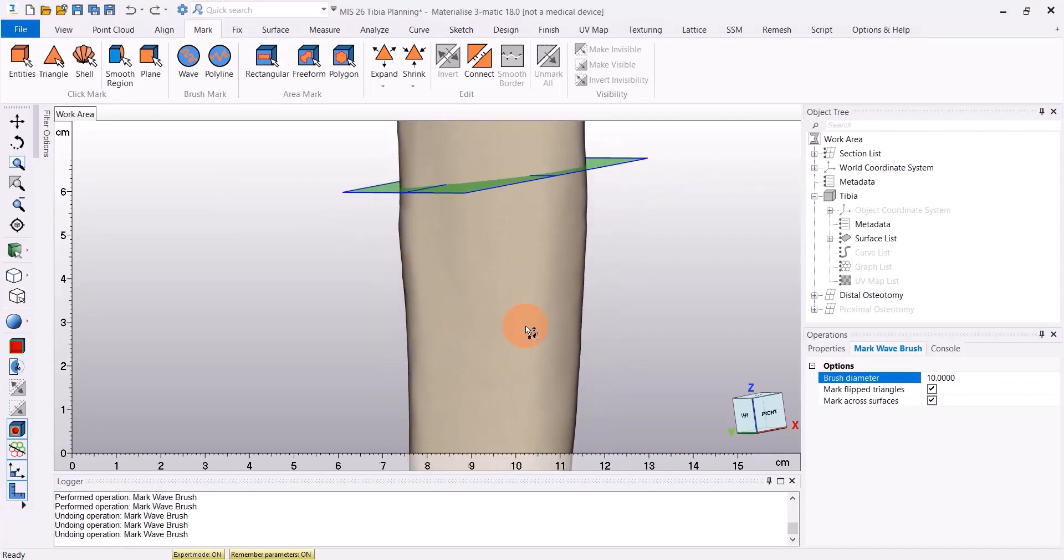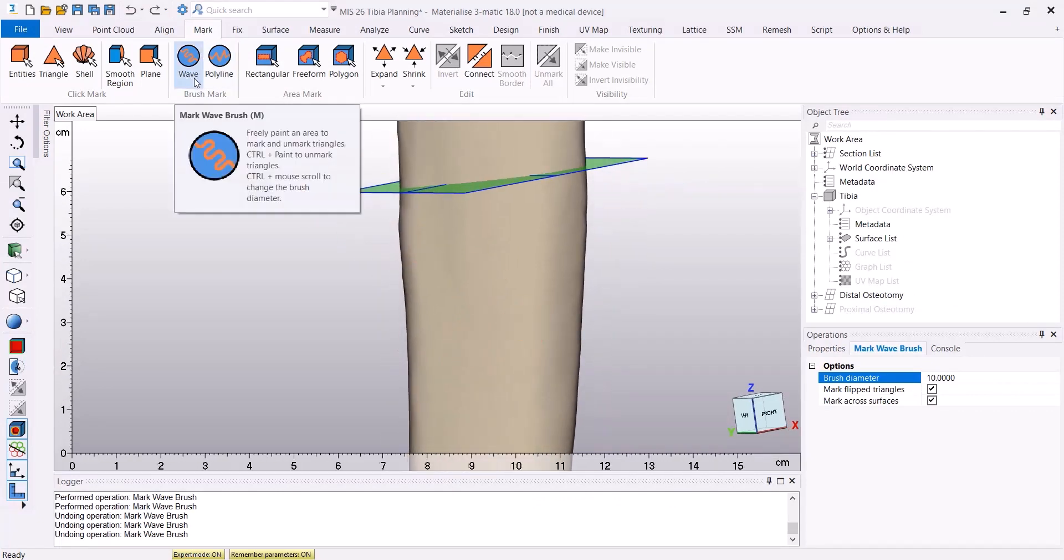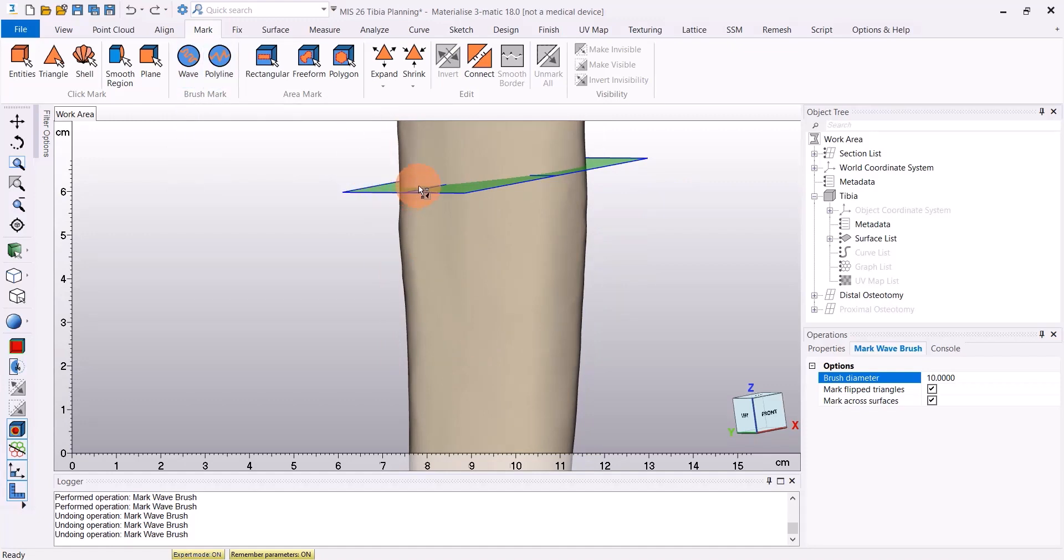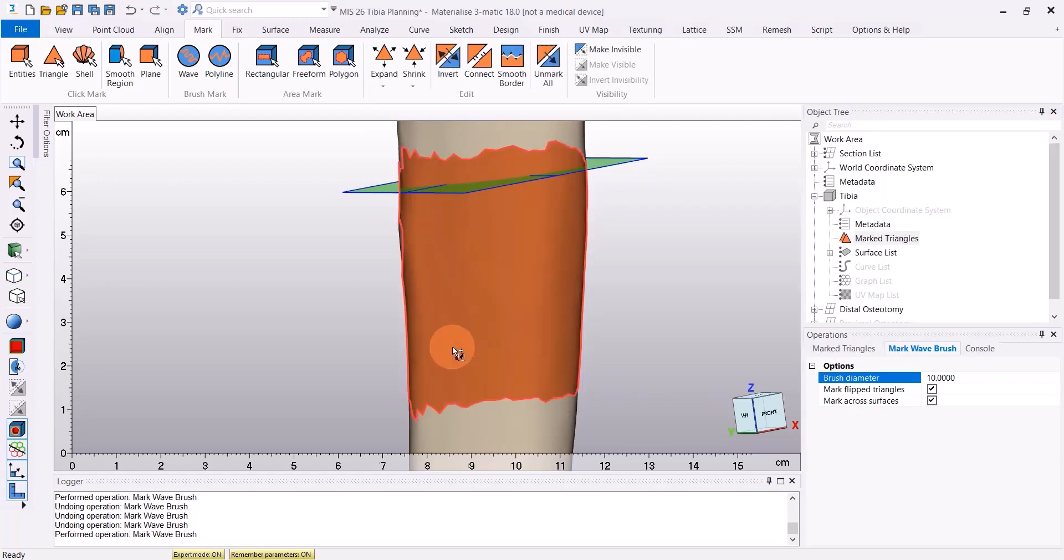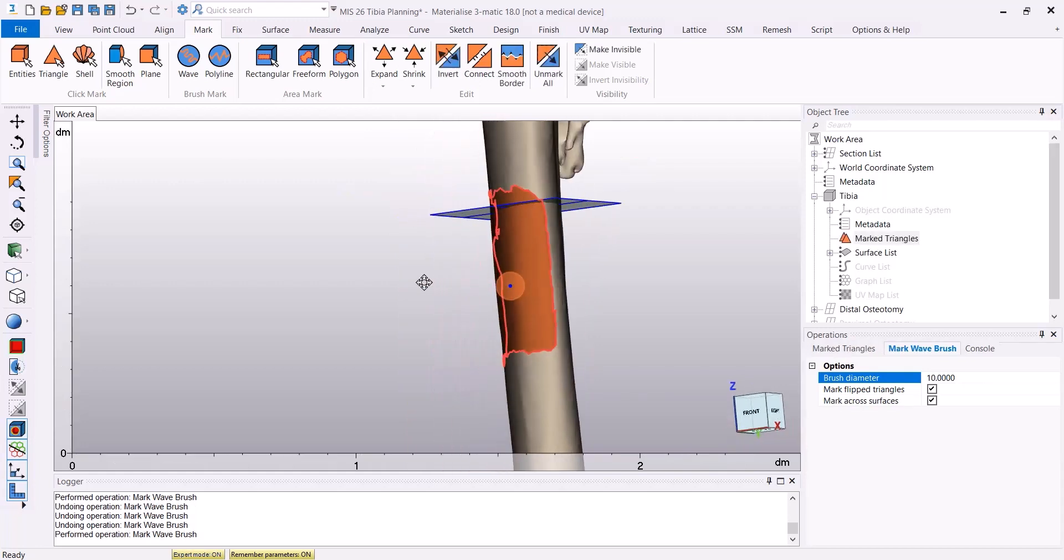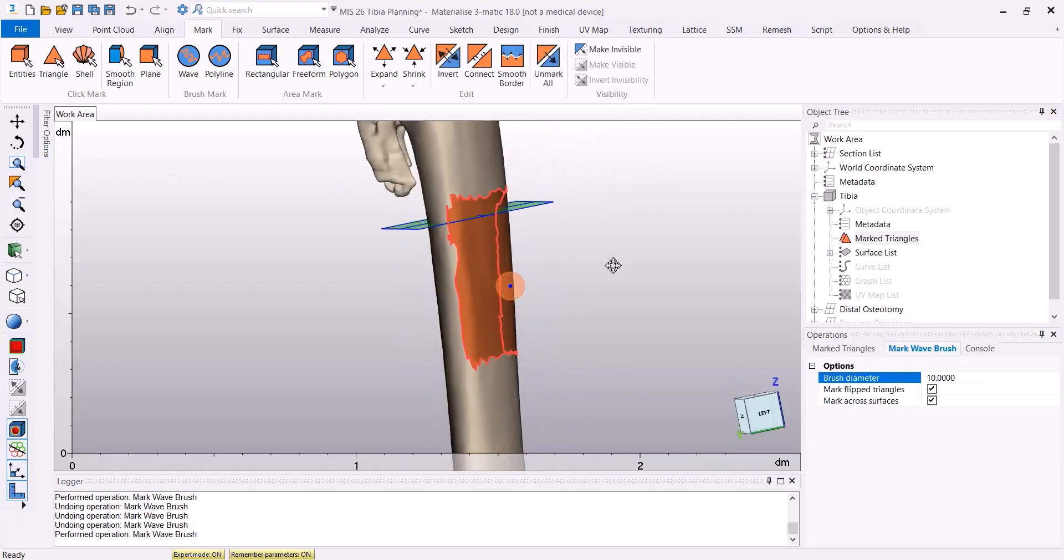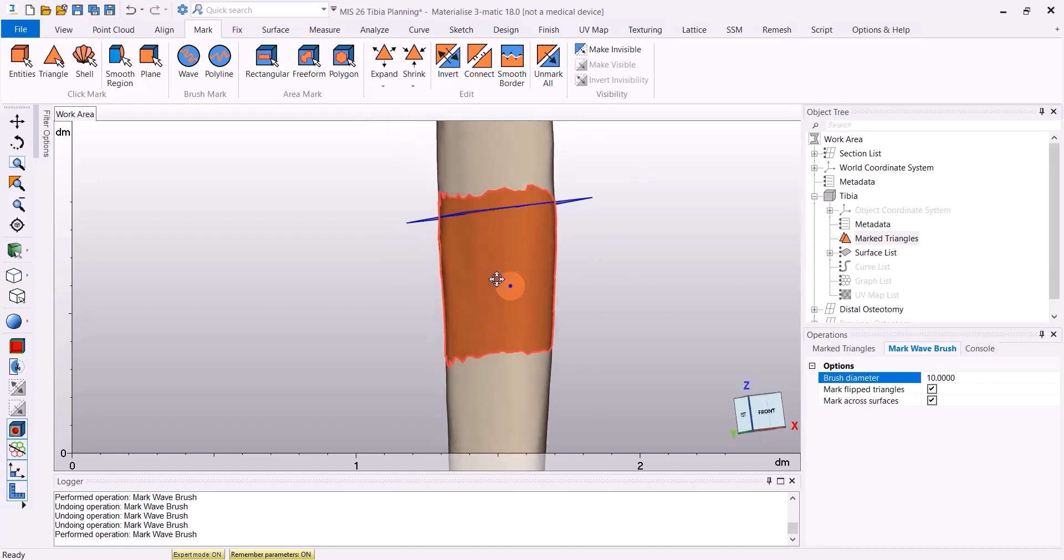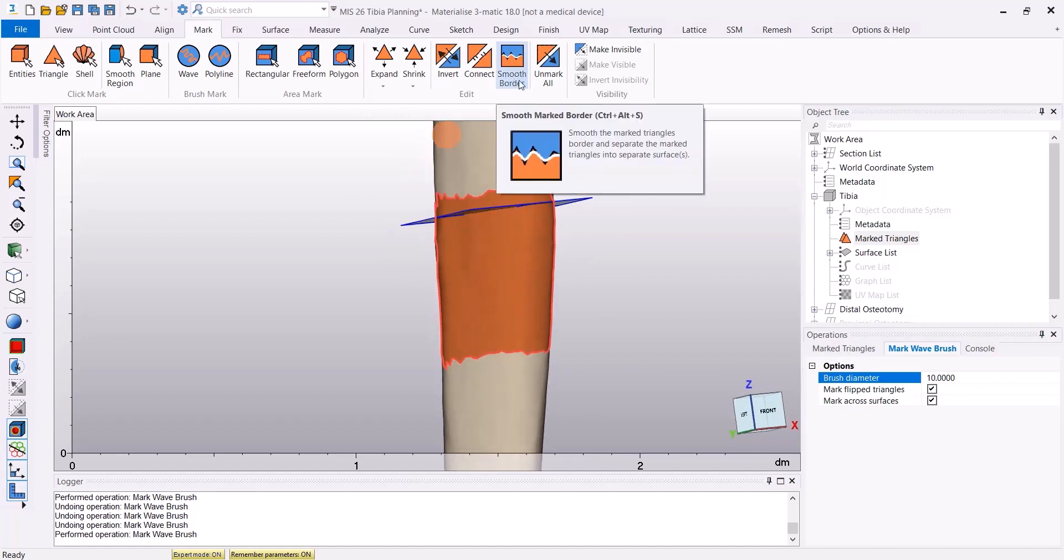The first step here is to mark the surface where we would like our guide to fit, using the wave brush tool under the mark menu. Here I'm going to mark the triangles. After the triangles have been marked, I'm going to smooth the borders using the smooth border tool.